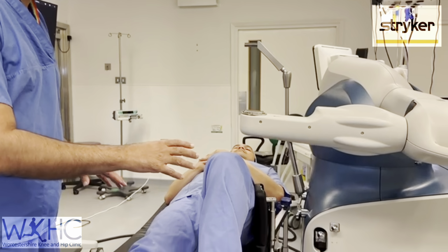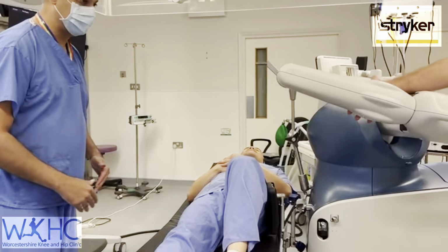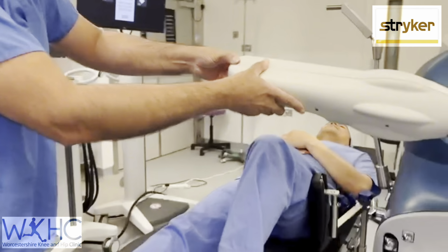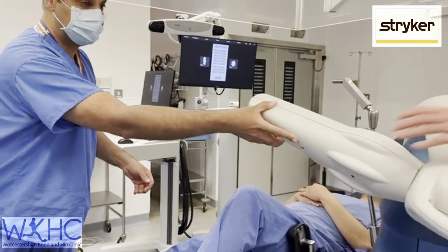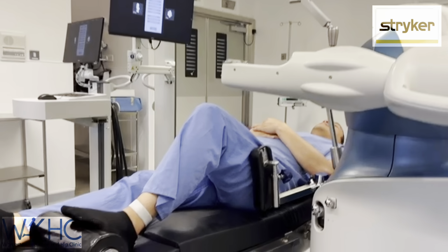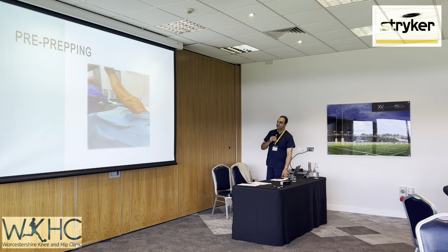So for a few cases, what we found was the robot kept cutting out. So this elbow needs to be at 90 degrees in a position where it can make the cuts. If it's hyperextended or hyperflexed, it will cut out. So this is just demonstrating the robotic arm. It demonstrates the positions that are ideal in order for you to get the absolute best cutting.